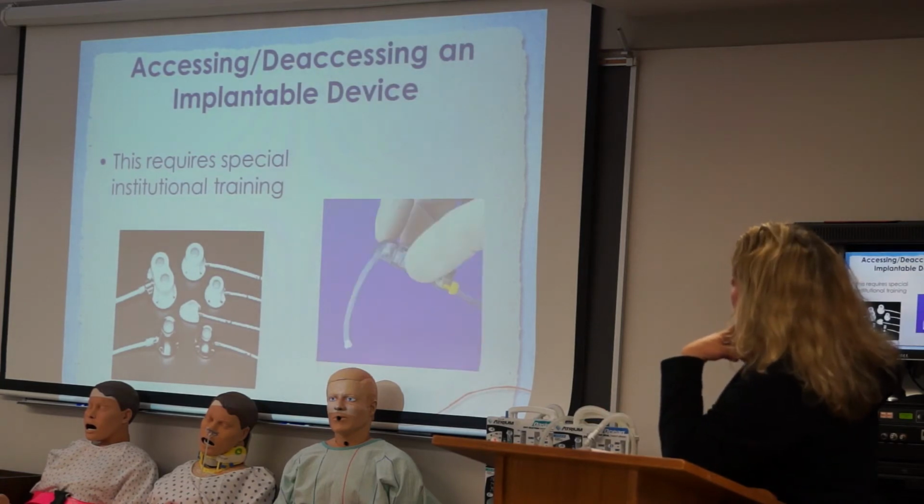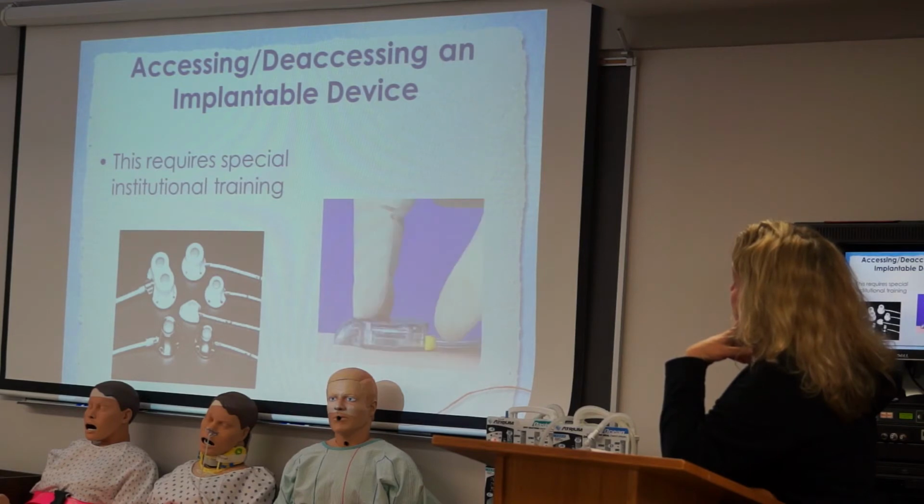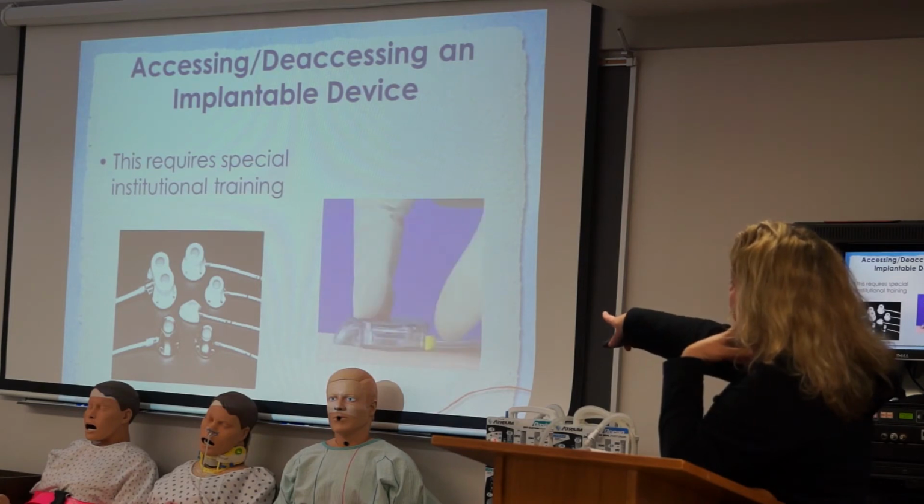Accessing a port, you really need to be specially trained to do this. This is not something you can just learn to do on your own. This is showing you the Huber needle here. It has to go straight through.